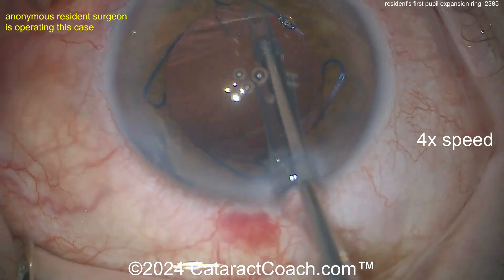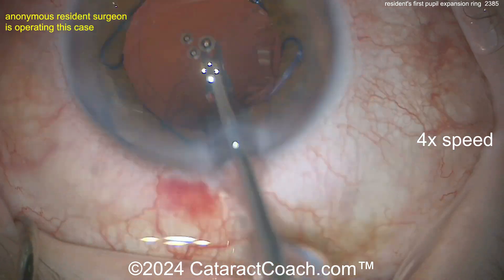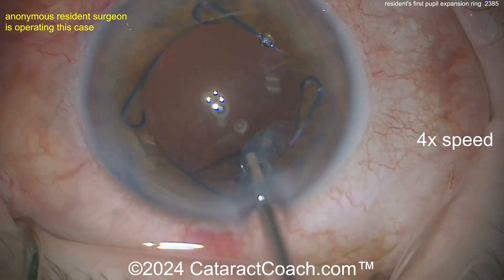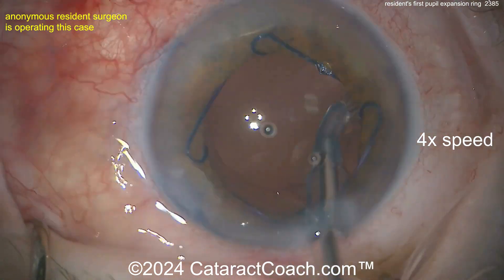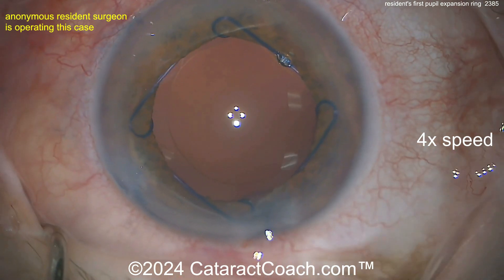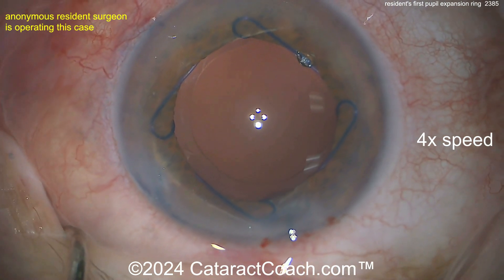Once that's cleaned up, let's get the lens in the bag and see the technique for how to remove the Malyugin ring. If you're going to use pupil expansion rings, don't wait till you have that really difficult case with a shallow anterior chamber and a super tiny pupil — learn to use it in a case that's not so bad, like this one. That's a smart move when you're a young surgeon in training: learn as much as you can, as much hands-on as possible.